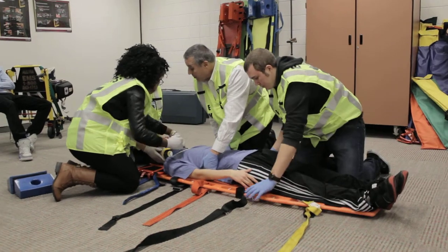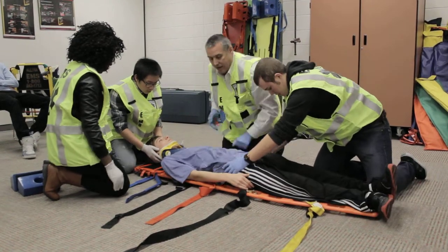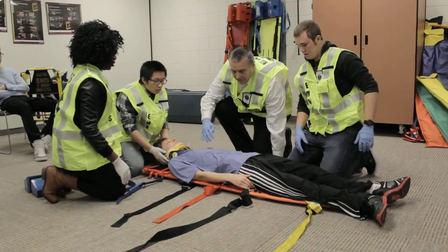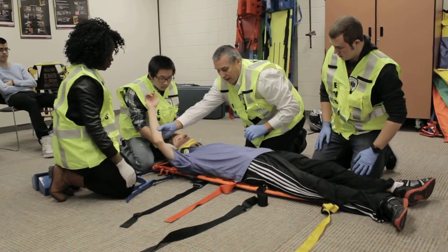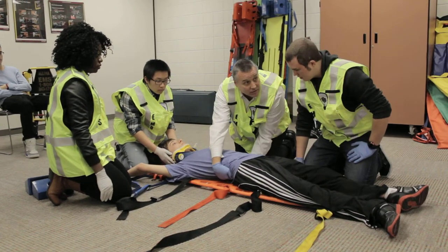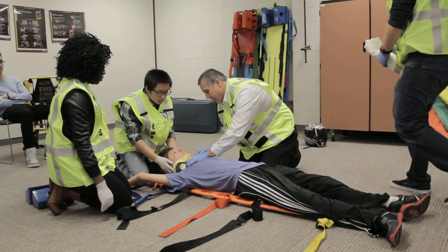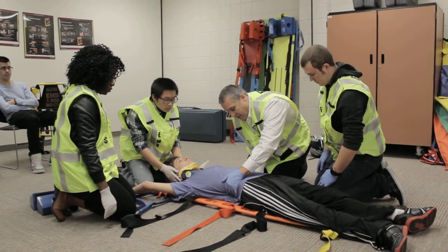We are going to slide him down and then up. One, two, three. I'm going to check to see if he's straight on the board — we're good. I'm going to check for voids underneath his neck and a void in the middle of his back, and he does have a void. Can you grab a trauma dressing for me please? We're going to pad that void in the middle of his back. Perfect.